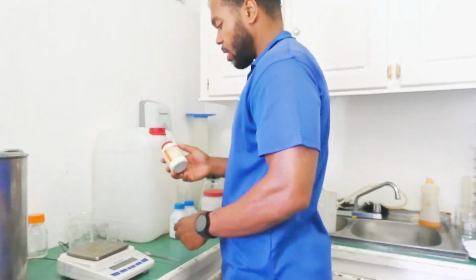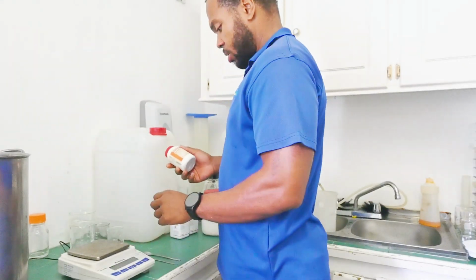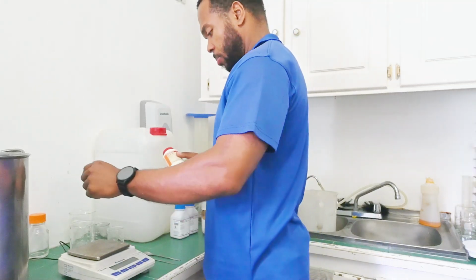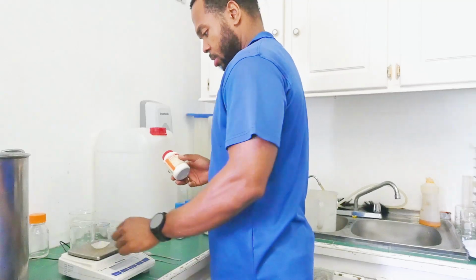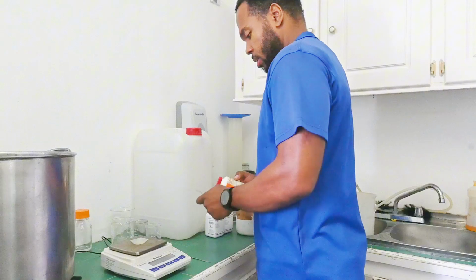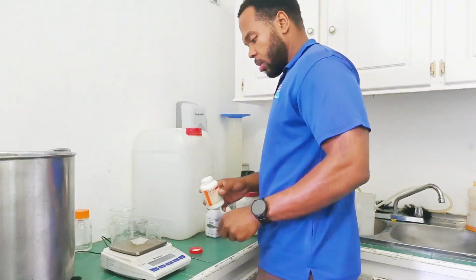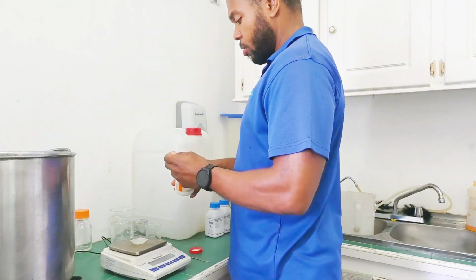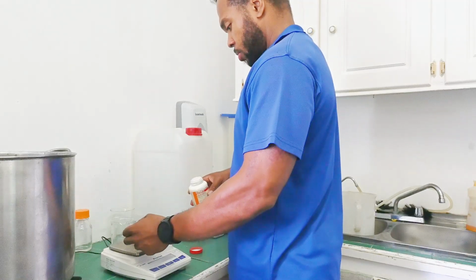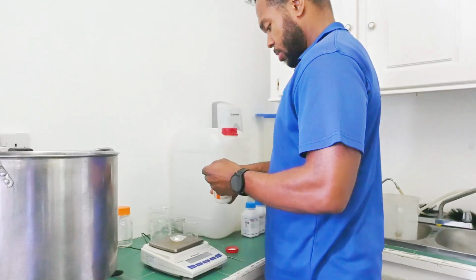We're going to start with the myo-inositol. It's another growth agent for the plant medium. We're going to weigh the tray as normal, minus the weight. And this one is 0.10 grams per liter. So you're going to add a total of 1.60 grams.